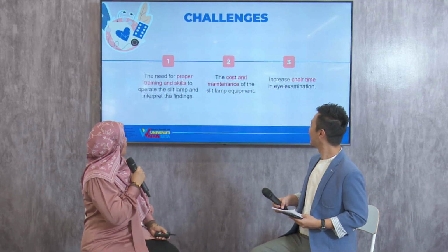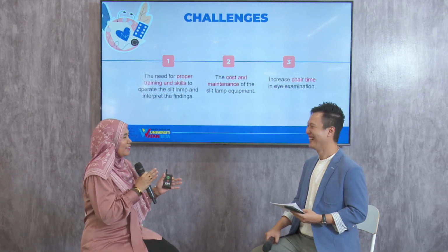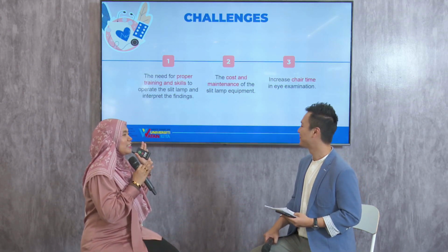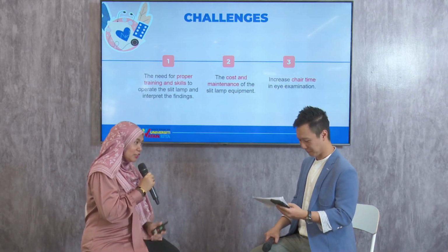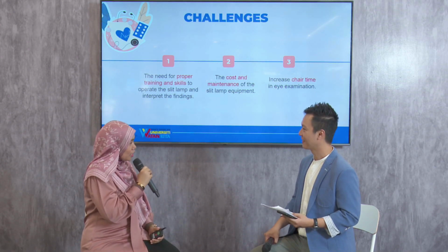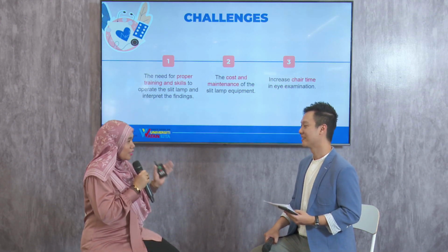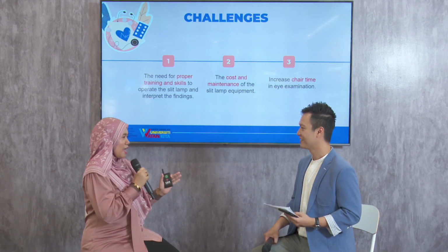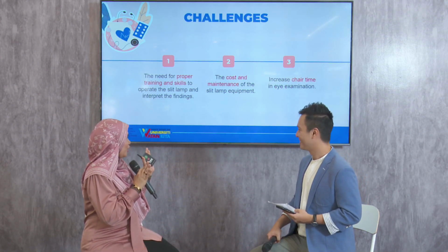The challenges: because of that intimidating instrument, it needs highly trained and skillful ECPs. Fortunately, in our education system, once you graduate in optometry, you are sufficiently trained to handle the slit lamp. So you are in good hands, and slit lamp eye examination is a breeze, hopefully.